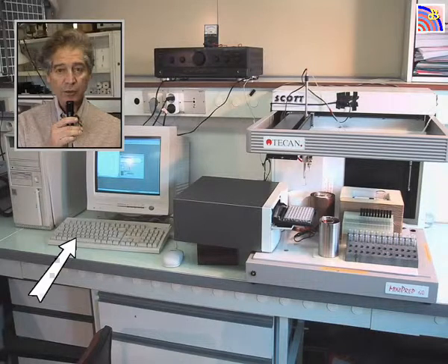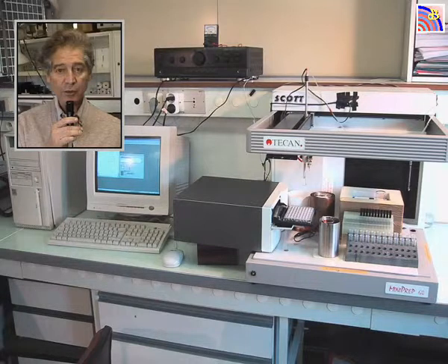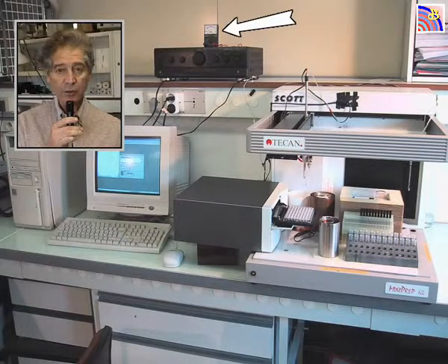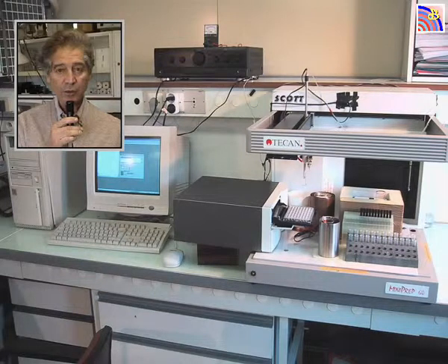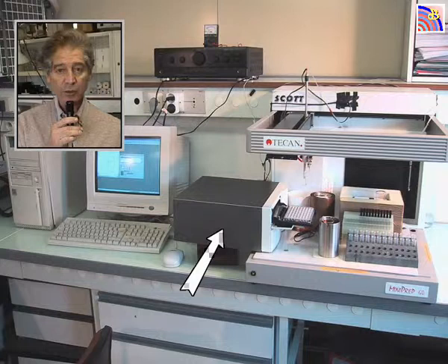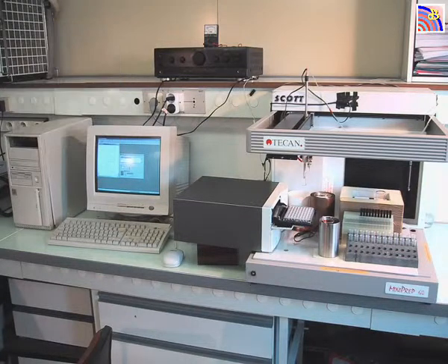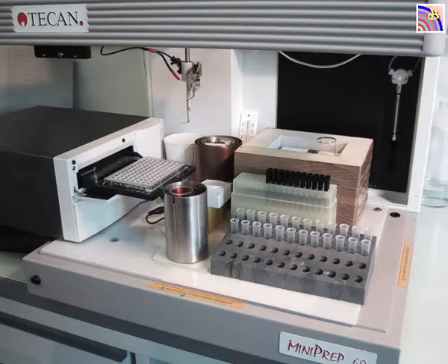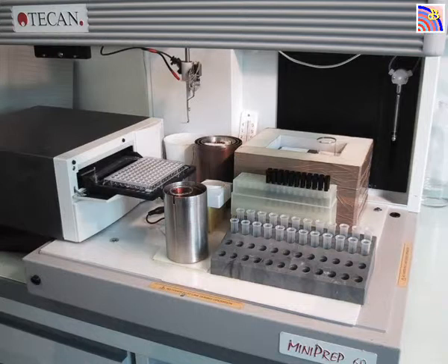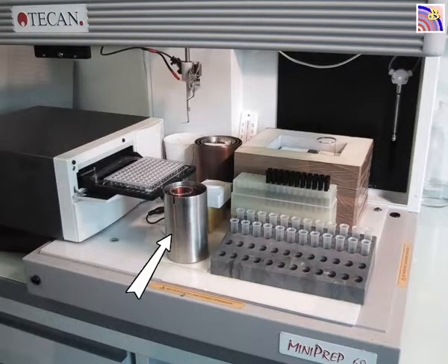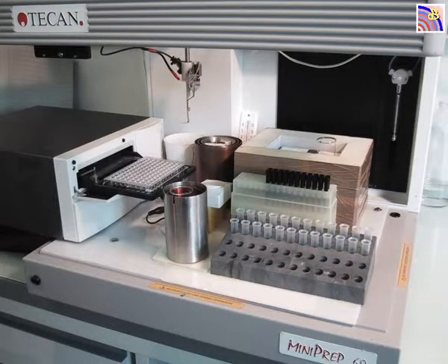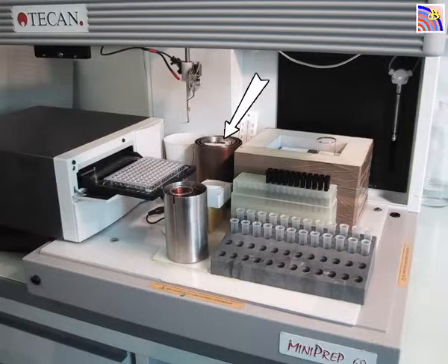Now you see the general layout of the system. There is a computer that will deliver the signal, the amplifier with a tester on top of the amplifier. On the right you see the automatic analyzer itself, including a spectrophotometer with a 96-well plate. In the front is the rack with empty tubes, behind it disposable black tips, and behind those a box containing the plasma. On the left, the small cylinder contains water with calcium chloride, adjusted to start plasma coagulation after around 15 minutes. The copper cylinder on the back contains the coil that will deliver the signal to the water.